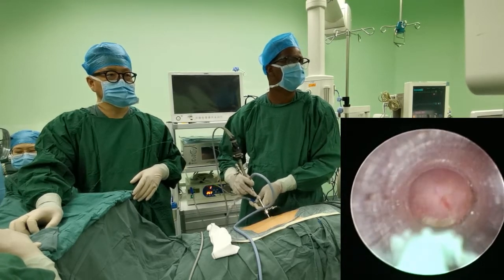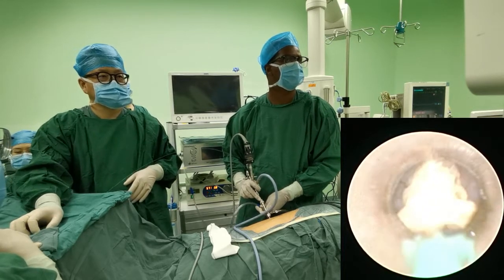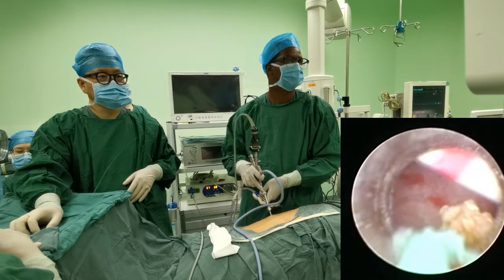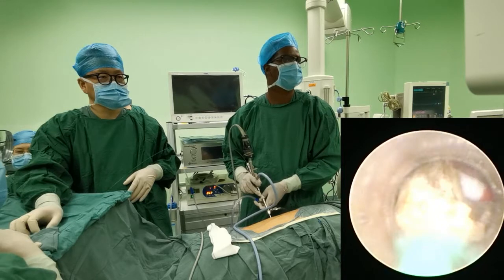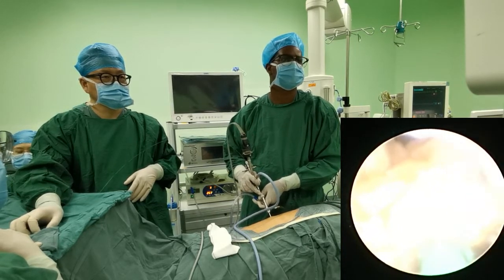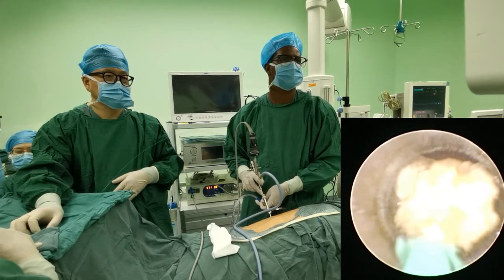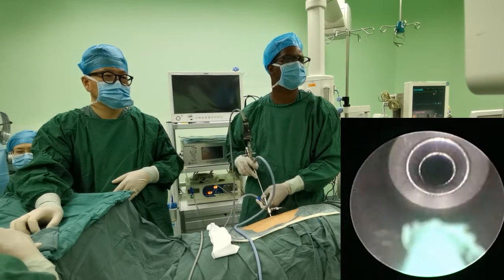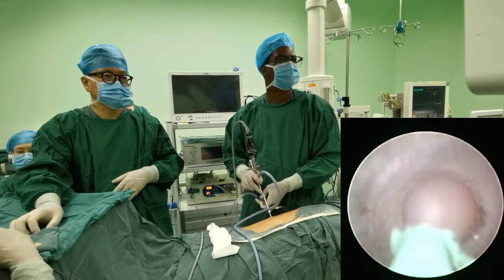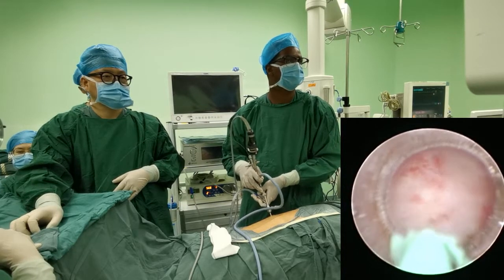In this video, we introduce the SMP technique step by step. The basic components of the SMP system are an 8 French miniaturized nephroscope with a newly designed irrigation suction sheath. The sheath has a handle consisting of an irrigation port, a straight tube, and an oblique bifurcated tube at 45 degrees. The suction port is located at the end of the oblique tube. The straight sheath is two-layered: the space between the two layers functions as a channel for irrigation water, and the central lumen works as a conduit for continuous suction. Side holes at the sheath tip allow egress of irrigation through the irrigation channel.